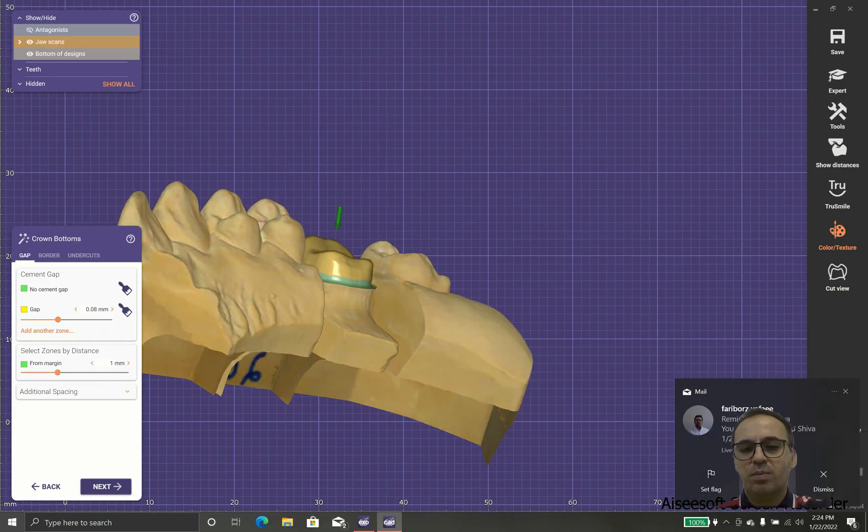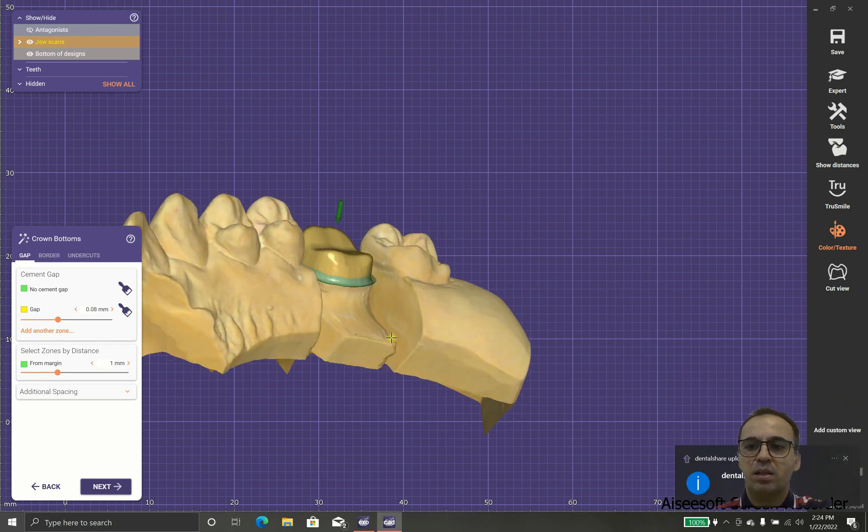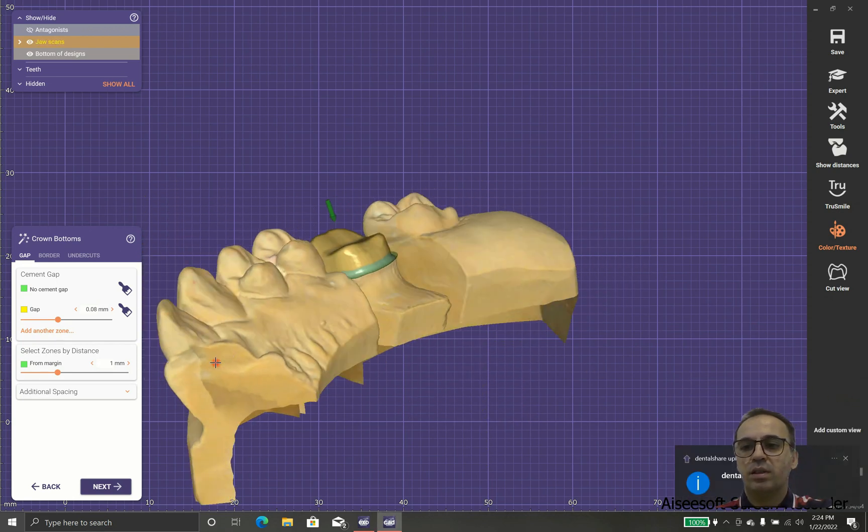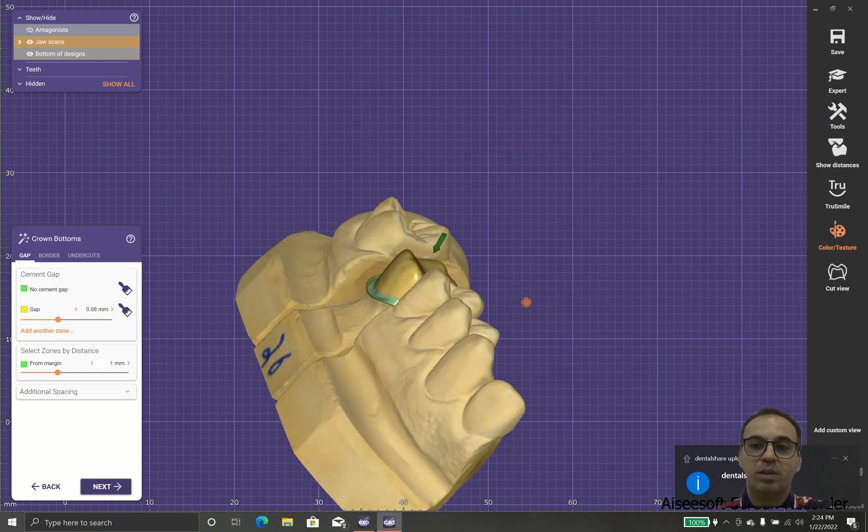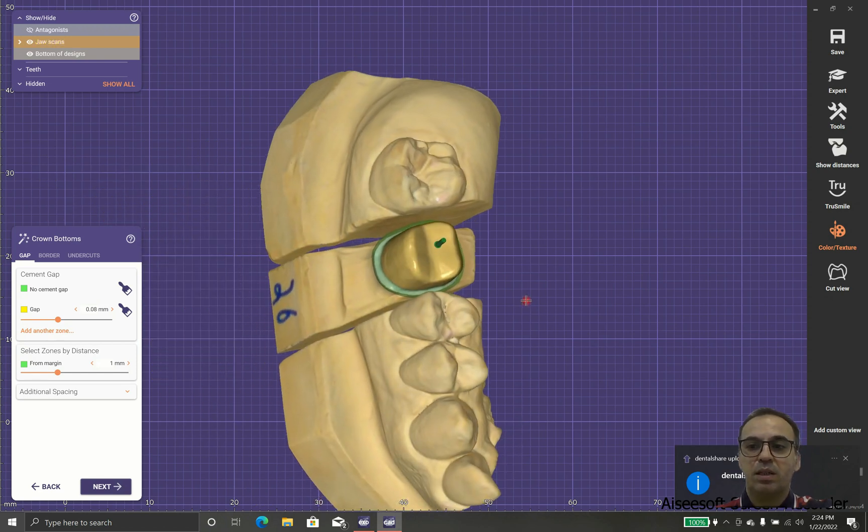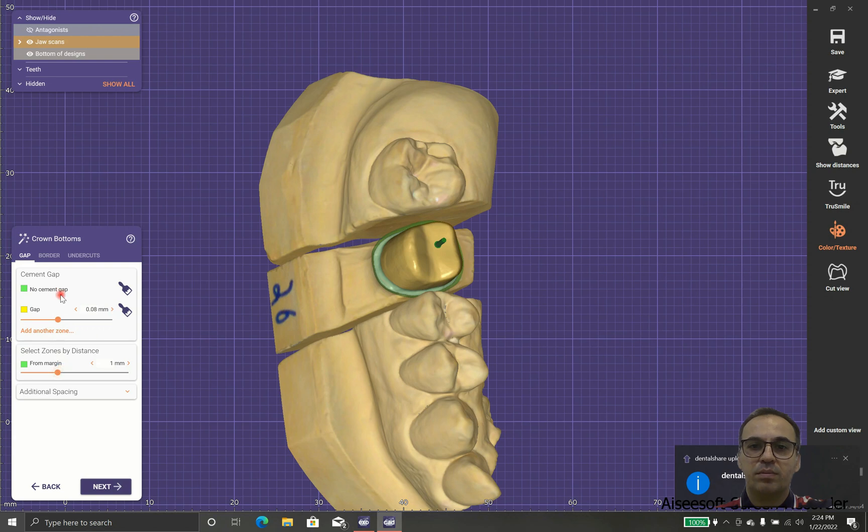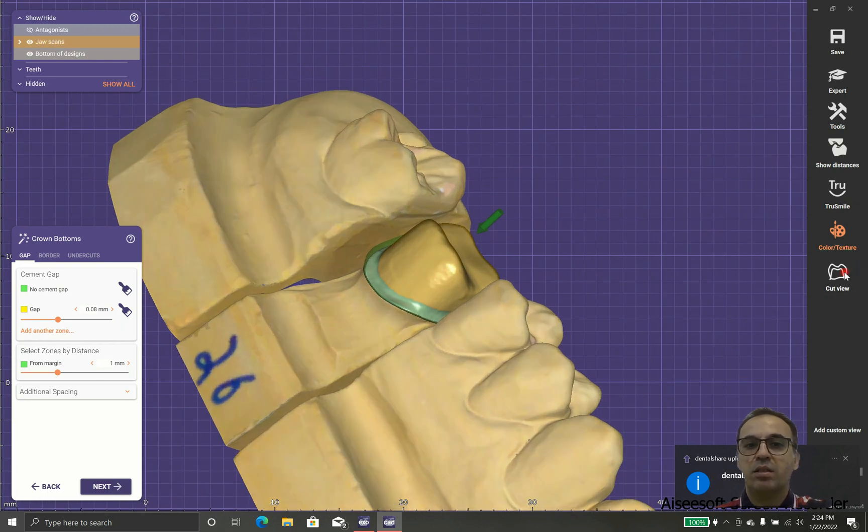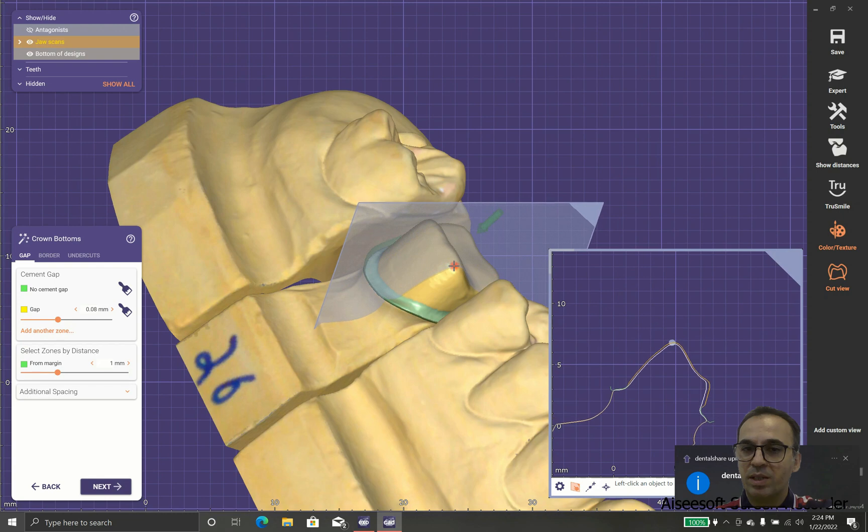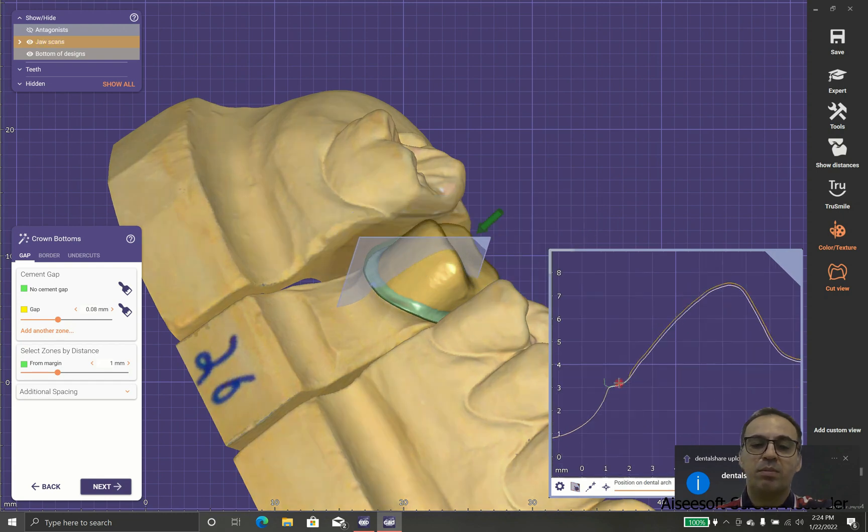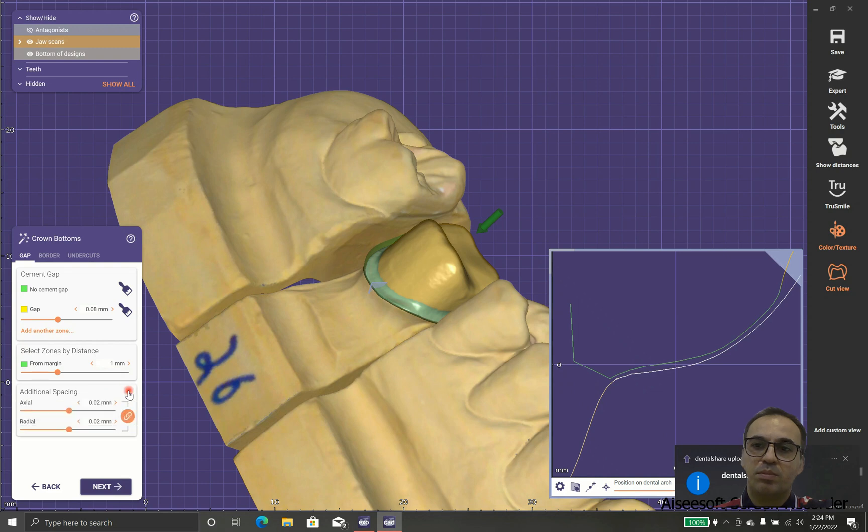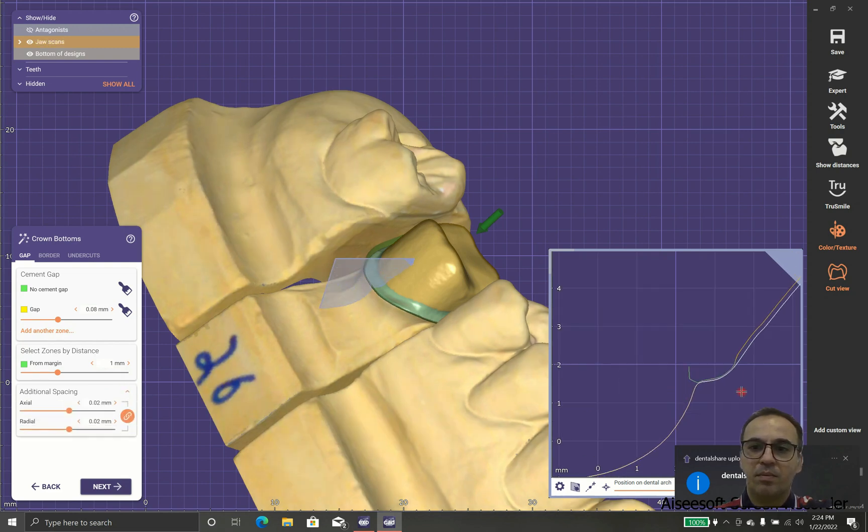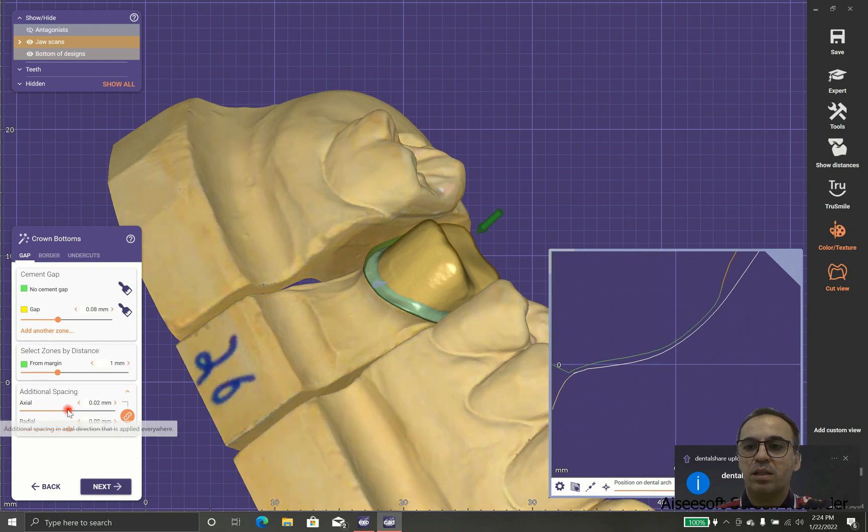In the next part we have the crown buttons. This part is very important because it shows us how the final crown insides will look like. As you can see, there is a green part with no cement gap or zero cement gap, and the yellow part with 0.08 cement gap.